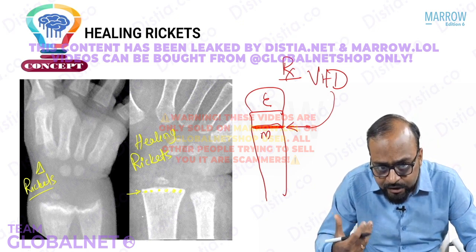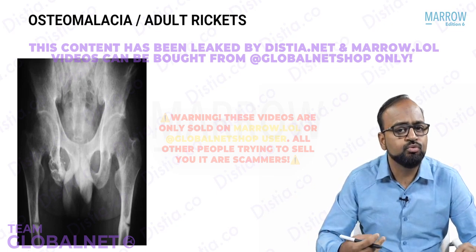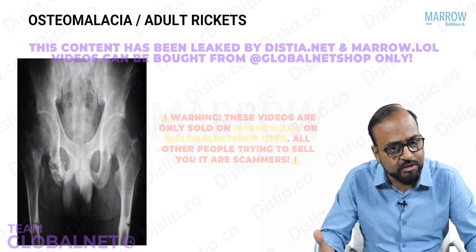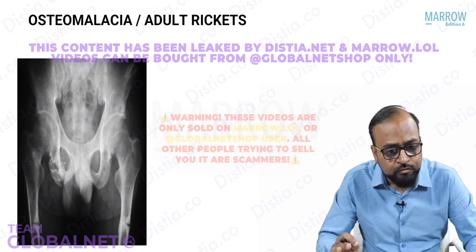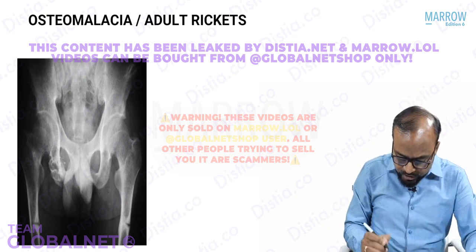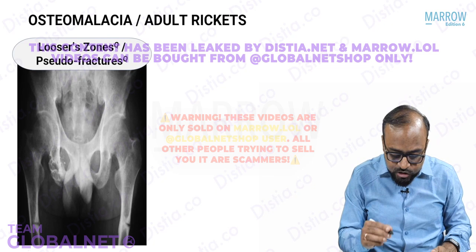Now, vitamin D deficiency affecting adults, or adult rickets, is called osteomalacia. Again, it will give rise to delayed or decreased mineralization, lack of osteoid mineralization. Weak bones will happen, diffuse osteopenia will happen, and there is a very peculiar feature which is seen especially involving the femur, where you see transverse lucencies involving the cortex. These are given a name. These are called pseudo fractures or Looser zones.